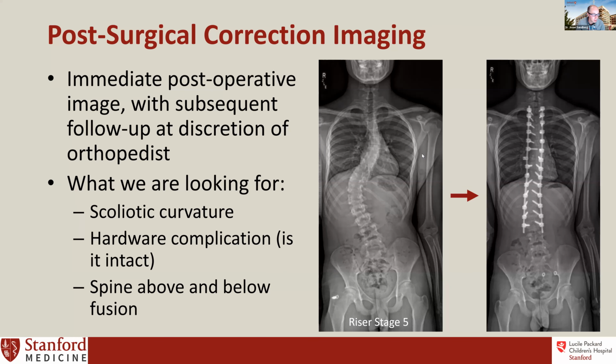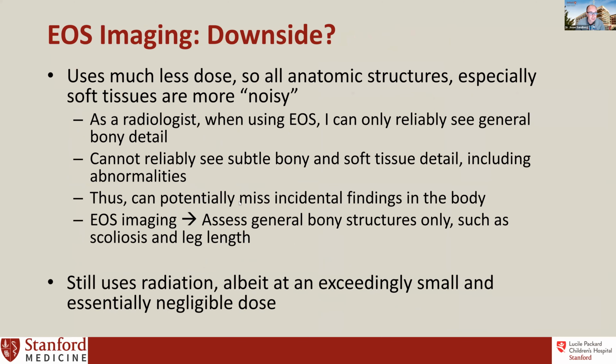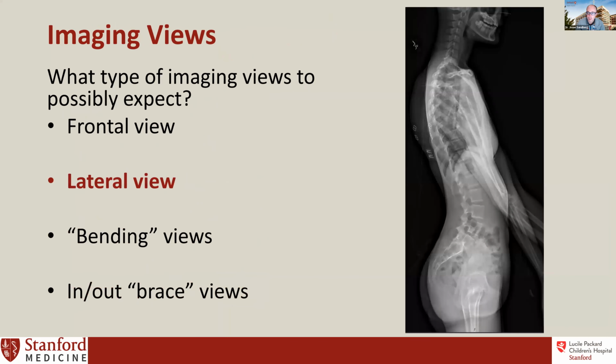Now, when you're looking at images with your orthopedist, they will generally flip the images. They'll look at the image the way they'd look at the patient during surgery, more or less. So this should be marked. On a lateral, sometimes it's not, but let's see. Go back to my lateral. Oftentimes they won't label it, but you can look and see if you can see their face there, or the arms pushing forward, so you can kind of tell from the lateral view.